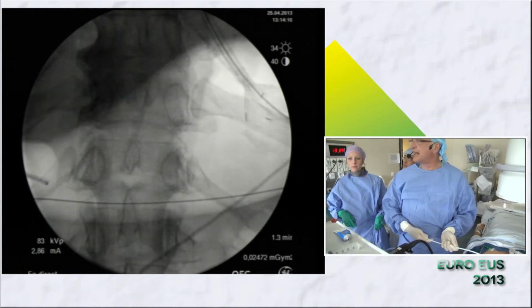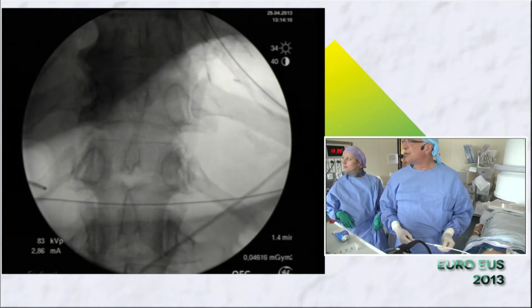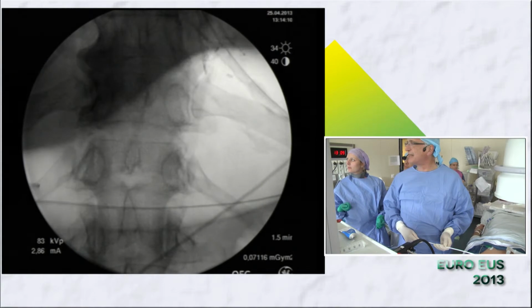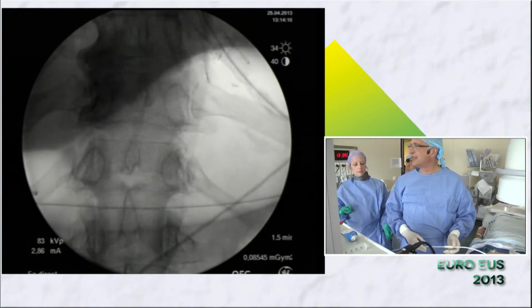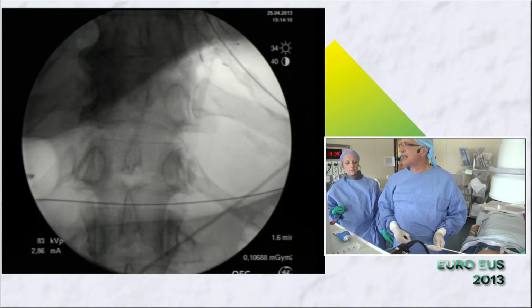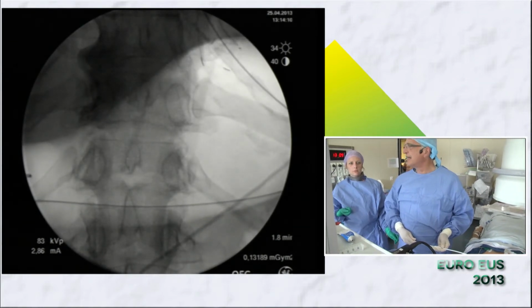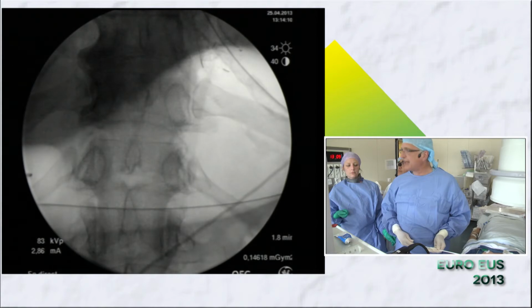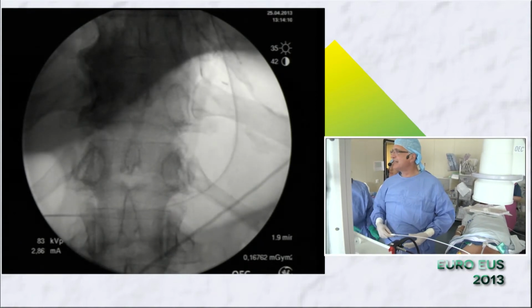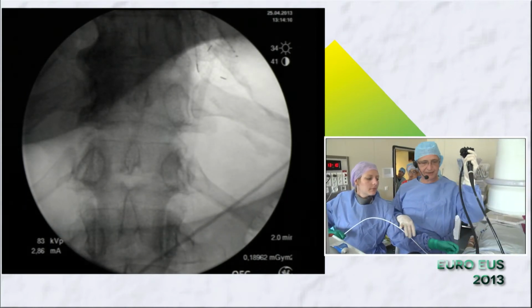So you see that obviously the stent is too low there, but now I can pull it back as close as possible to the cardia. This is the distal part of my stent which is important, not the proximal one. You see that there is still a tendency to migrate, so I can pull it back a little bit. The advantage is that I can reload it. And now here I'm in a good position. Looks excellent. And then very carefully, I keep my right hand fixed, and I'm just pulling back the sheath. Then the stent is released. I remove the introducer, and we will check if the position is not too bad.